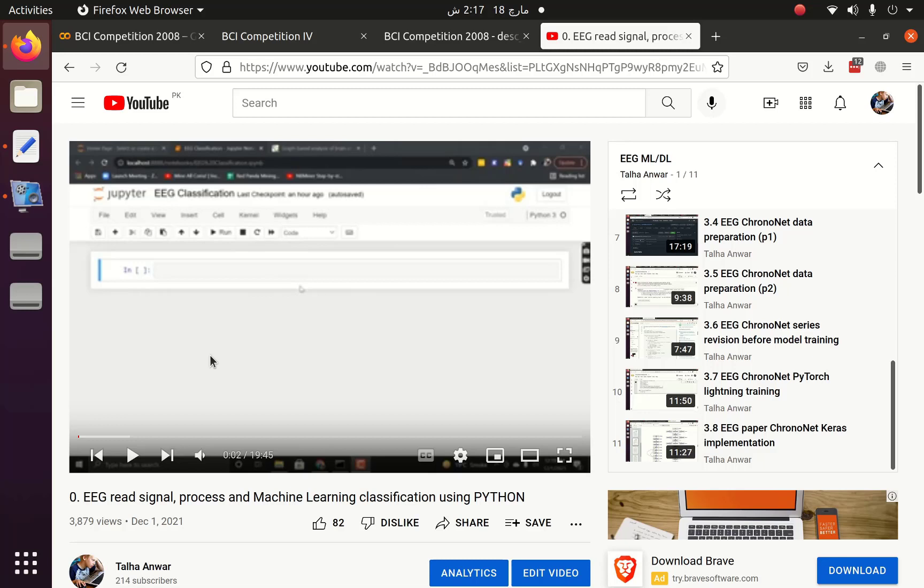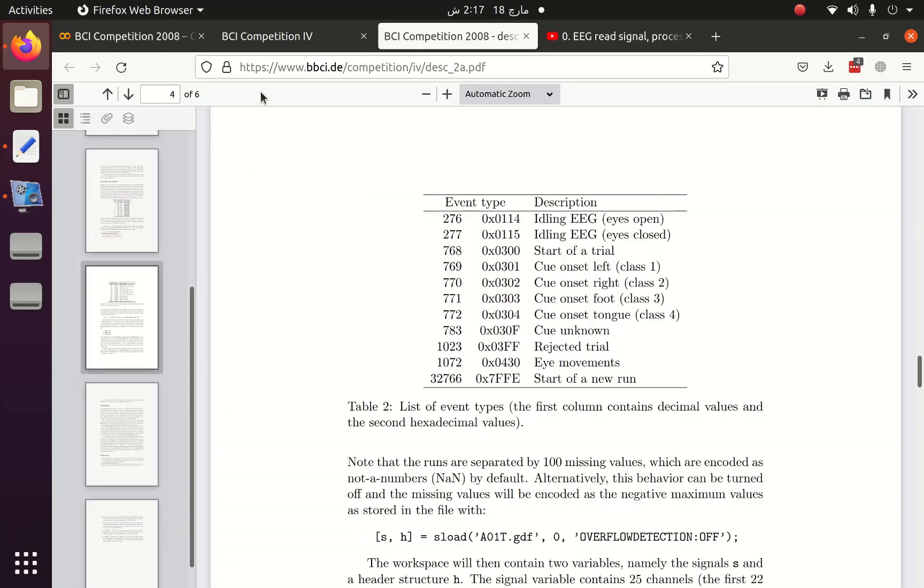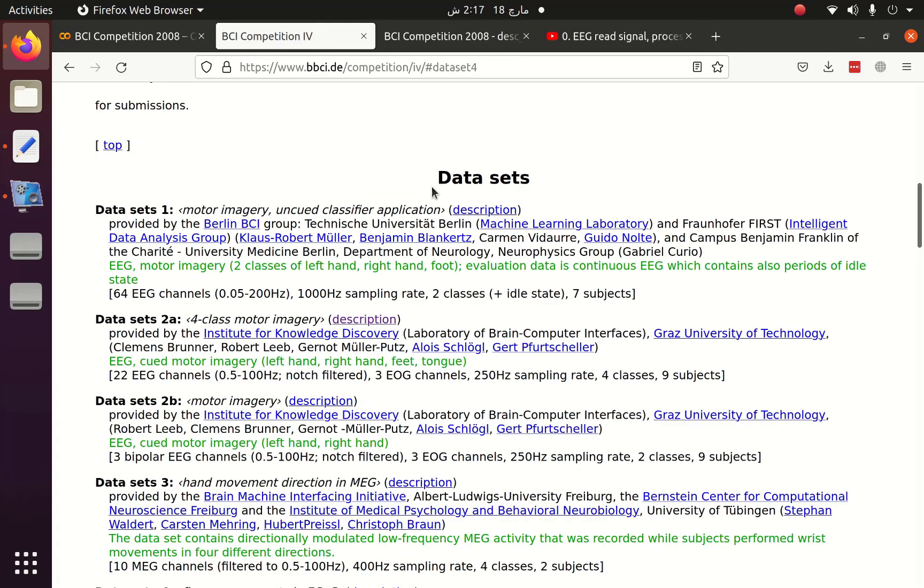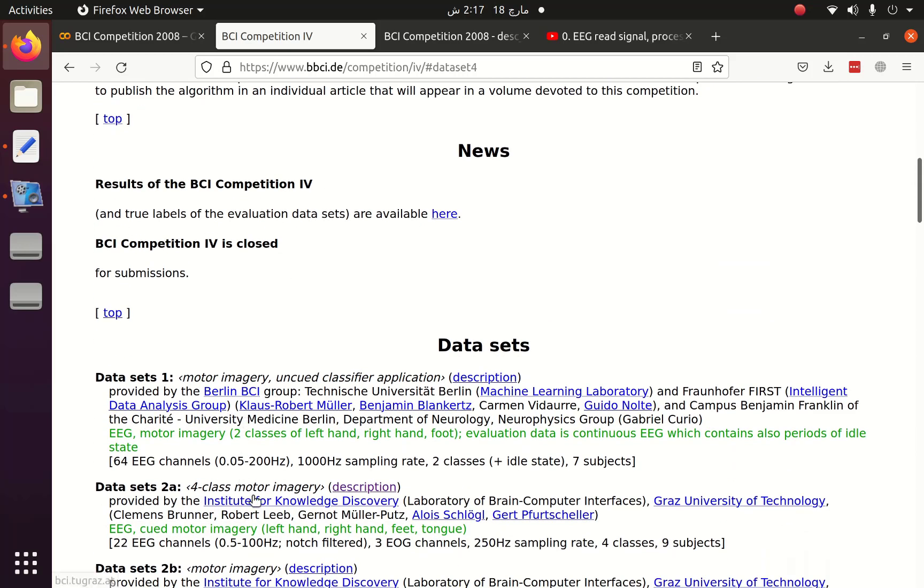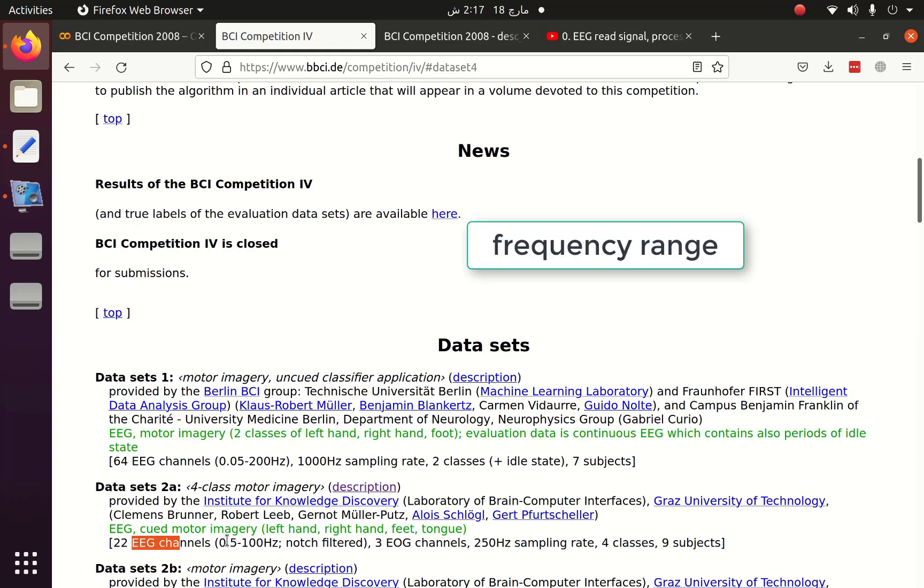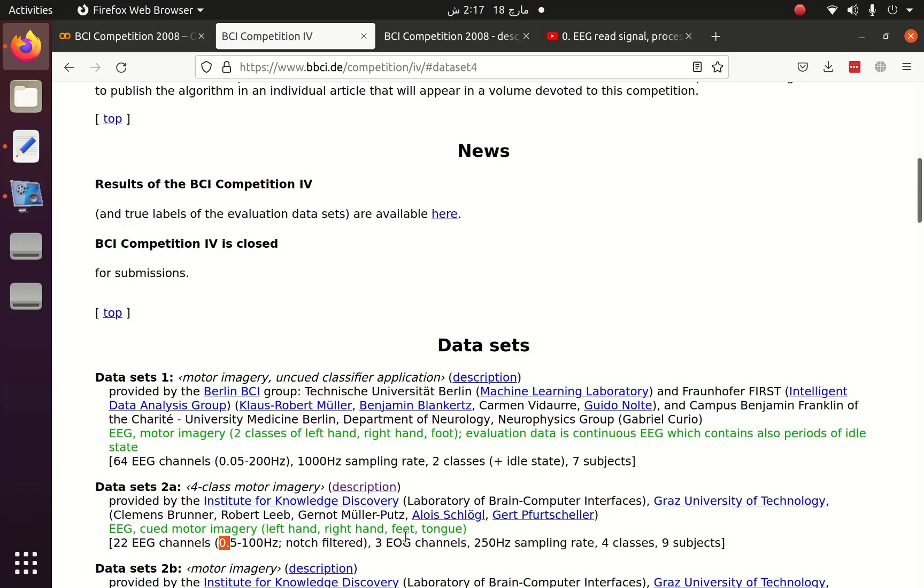This is part 3.9 of the EEG machine learning deep learning series. In this part we will see BCI Competition 4. There are multiple datasets in BCI Competition 4, but we are going to use the motor imagery dataset 2A. There are 22 EEG channels in this dataset, the range is 0.5 to 100 Hertz, and there are three EOG channels. The sampling frequency is 250 Hertz, the number of classes are 4, and total subjects are 9.